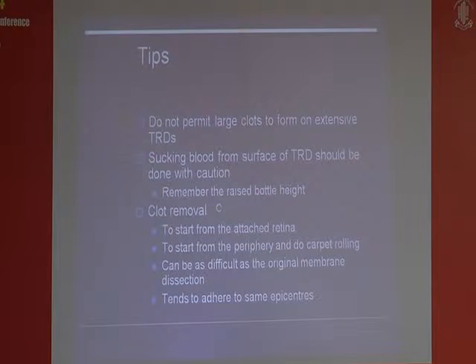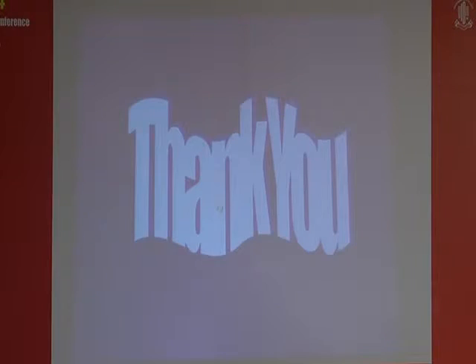It's better we don't allow large clots to form, because that is the time when we finally end up having iatrogenic breaks. These blood clots tend to follow the same structural adhesions like the membranes, the same epicenters, and it's better to start from the attached retina and then come to the detached retina by peeling.